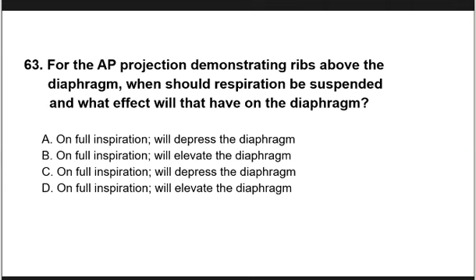Next number 63, for the AP projection demonstrating the ribs above the diaphragm, when should respiration be suspended and what effect will that have on the diaphragm? So in other words, mayroon kasi tayong different projections demonstrating the ribs above the diaphragm and demonstrating the ribs below the diaphragm.